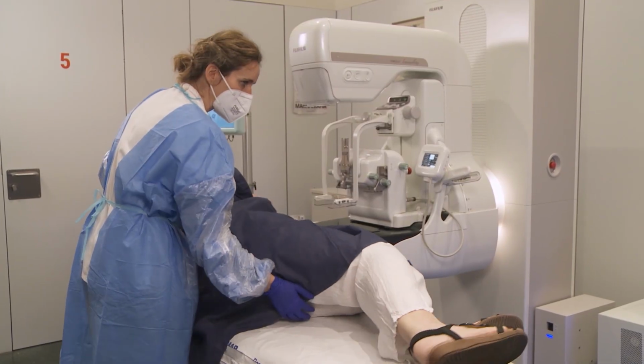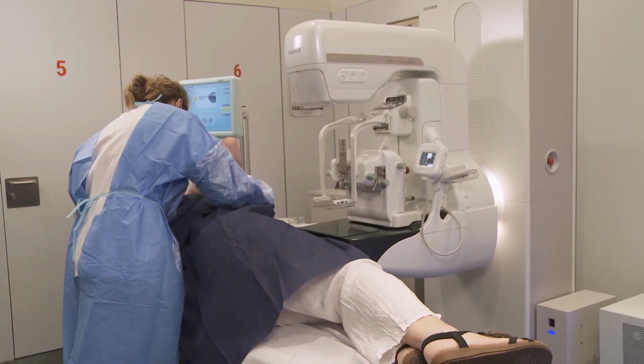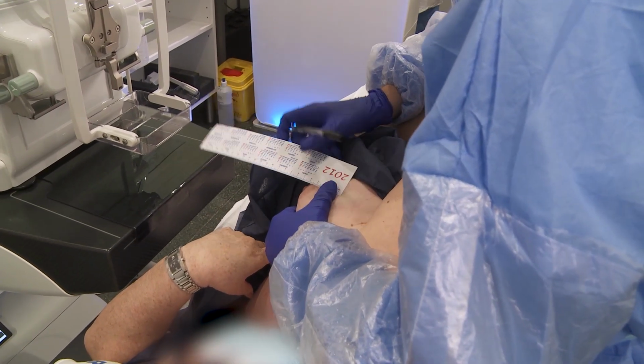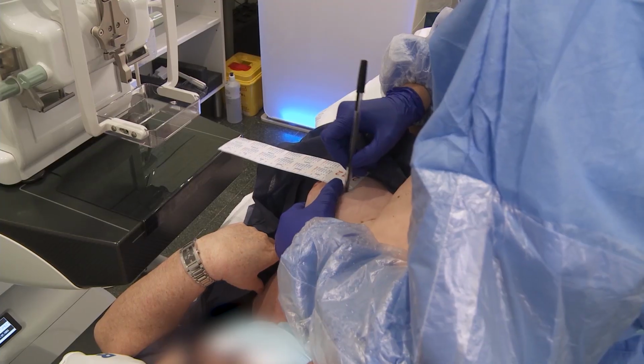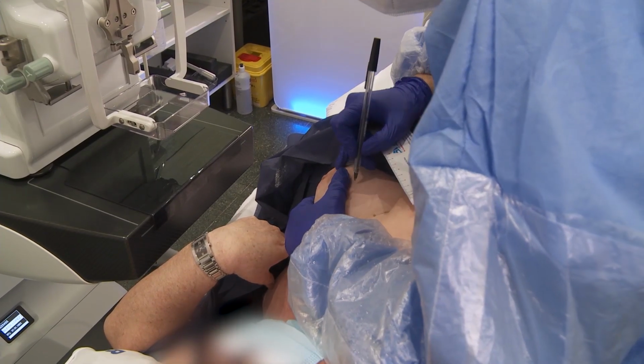The patient is positioned for a lateromedial projection, vertical approach, external access procedure. The measurement taken previously on the lateromedial projection image is replicated on the breast to facilitate positioning.